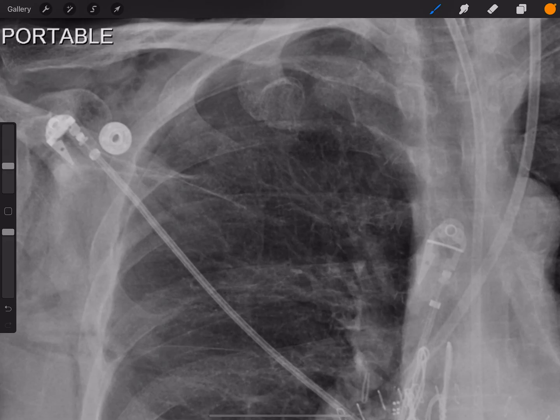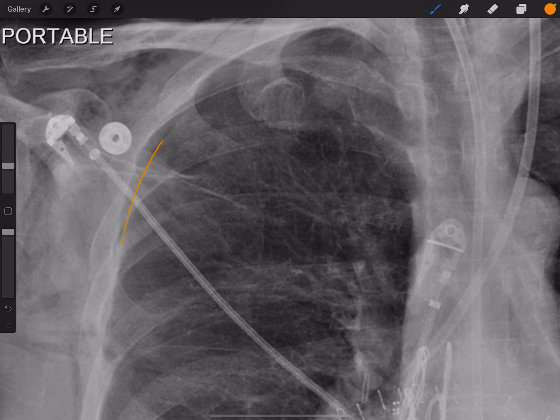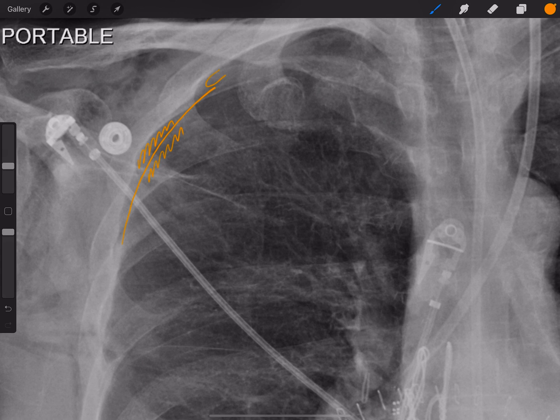Let's look at one last case. This is the third case, and I've zoomed in on the area of interest. Is this a pneumothorax or a skin fold? This is a pneumothorax. What we have here is a very thin radio-opaque line that represents the visceral pleura, with lucency in the pleural space and lucency of the lung on either side. There are no lung markings lateral to this line, and you can see the line continuing all the way to the apex — it doesn't just fade away like a skin fold.